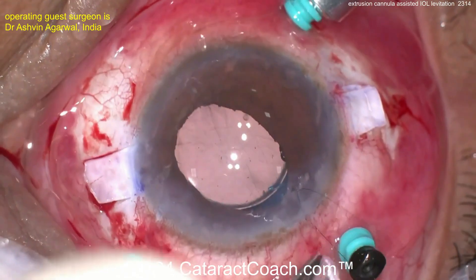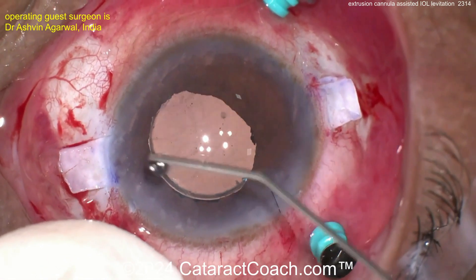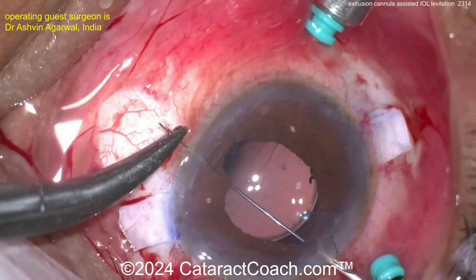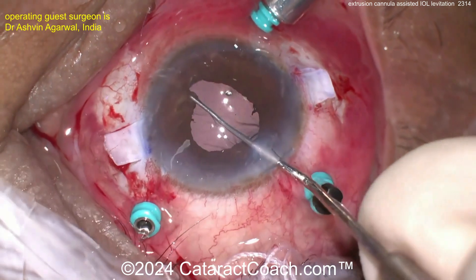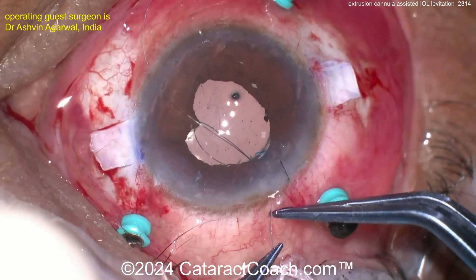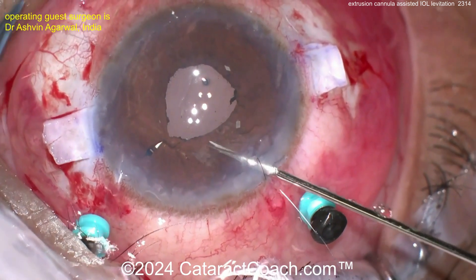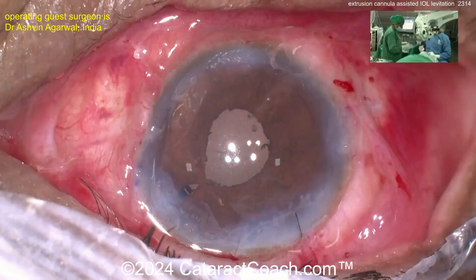Suture up that incision, then finish gluing up your IOL scleral flaps and you're done. The lens is beautifully centered. Maybe a little pupilloplasty is needed — a four-throw pupilloplasty right here. This patient should have a very nice outcome. And the best part: no more floaters, no more Weiss ring PVD floaters — all gone. That looks like a much nicer pupil.